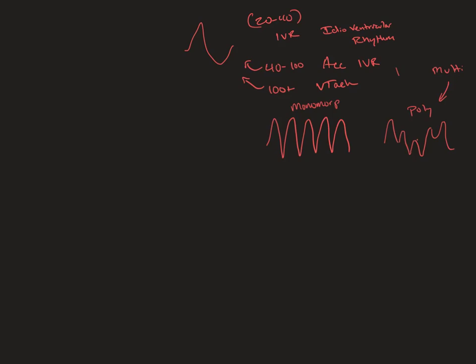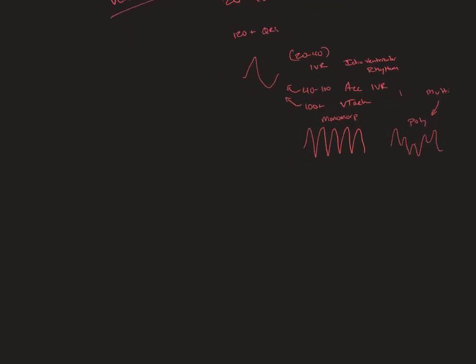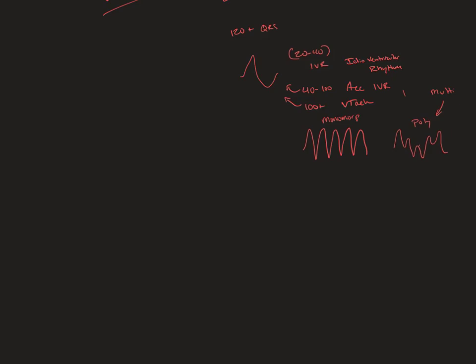The thing is, when you have these ugly QRSs, please look. If you have the LifePak 15, they switch to these arrows, which are kind of cool because they're easy to see. The problem is you'll look at it and it'll have an ugly looking rhythm, and then another, and you're like, wow, that's gross. But then you look at the bottom and it has these cute little arrows. Those are pacer spikes, or at least that's the LifePak 15's interpretation of a pacer spike.